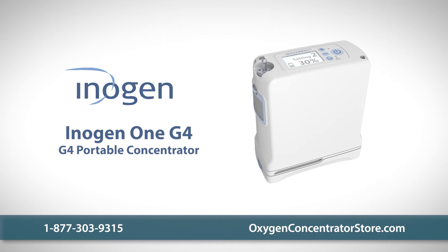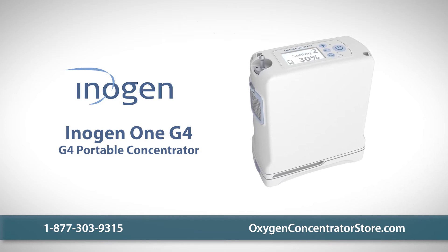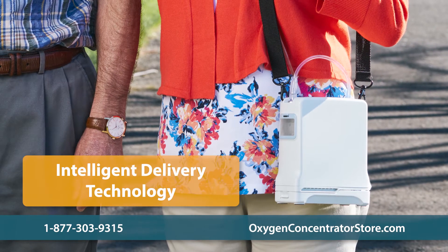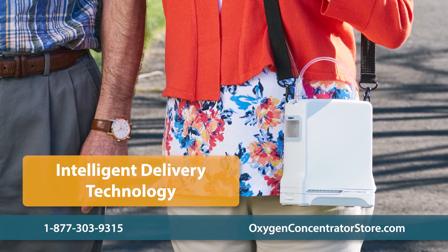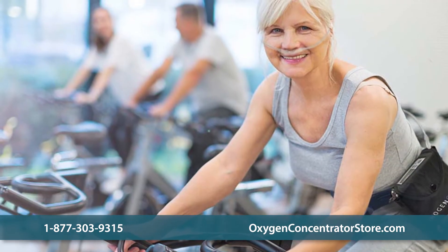The Inogen One G4 is the smallest oxygen concentrator in their award-winning line of portable concentrators. Utilizing Inogen's intelligent delivery technology, the G4 ensures oxygen therapy is always efficiently delivered, whether you're exercising or sleeping.